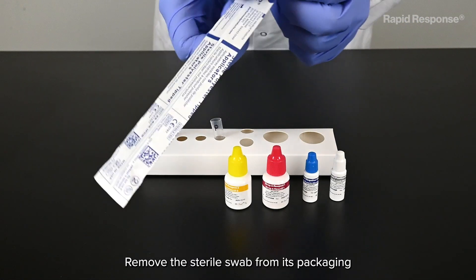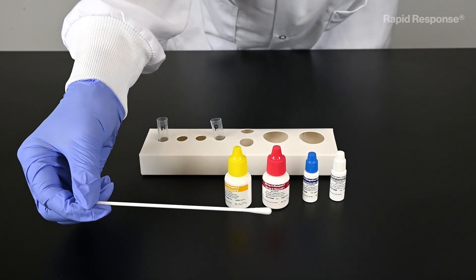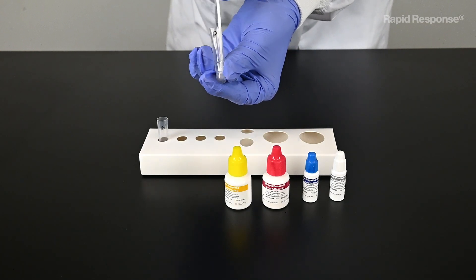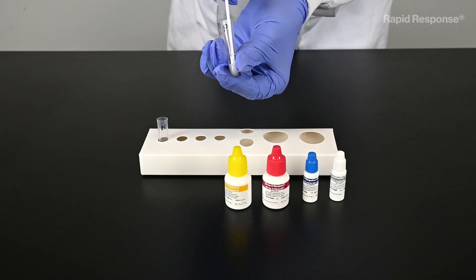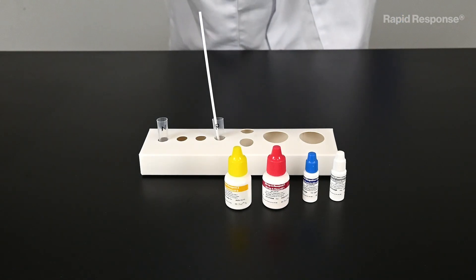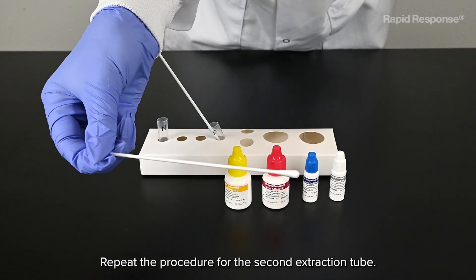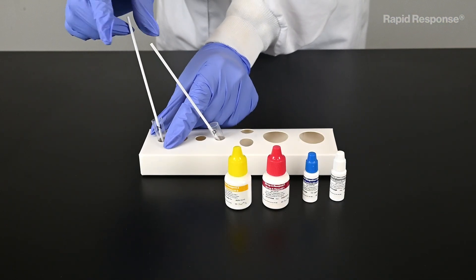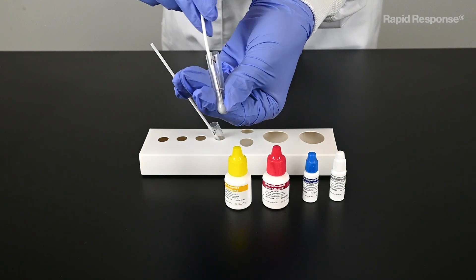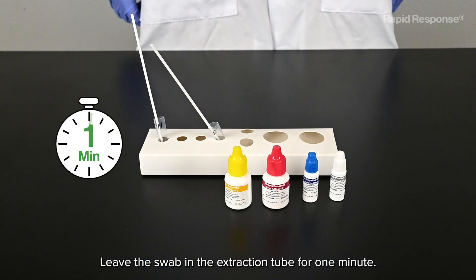Remove the sterile swab from its packaging and immerse it into the extraction tube. Swirl the swab in the extraction tube to mix it. Leave the swab in the extraction tube for one minute.